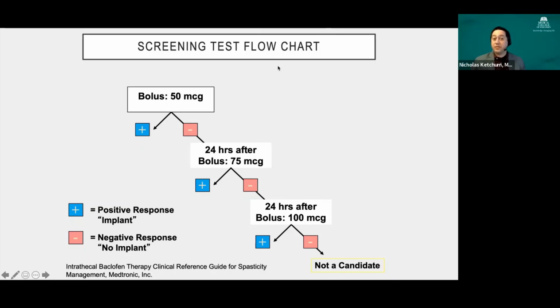Some of our patients, we actually reduce their spasticity so much that we unmask their true degree of weakness that wasn't apparent before. So they get apparently weak during the test dose, and that scares people if they're not prepared for it. They'll say, oh, it made me weak, I don't want this pump. But if they're prepared for the fact that this is a temporary one-shot approach, that it might unmask weakness, but if it does affect your spasticity, then we know with the baclofen pump we can give you the right dose for that individual to make it an effective treatment.